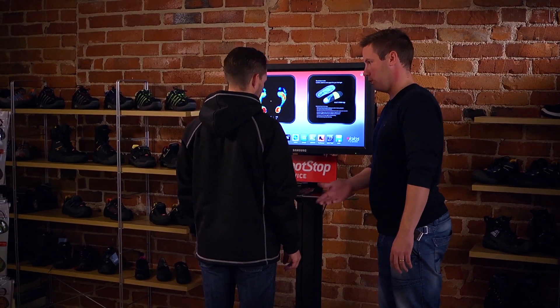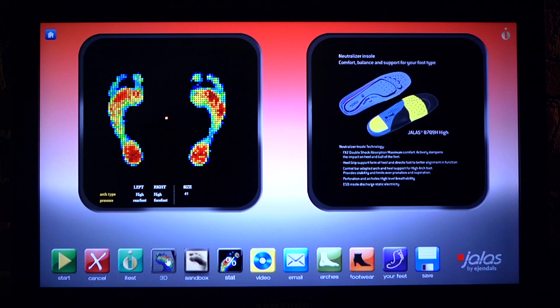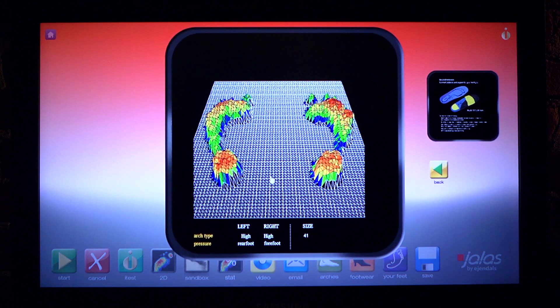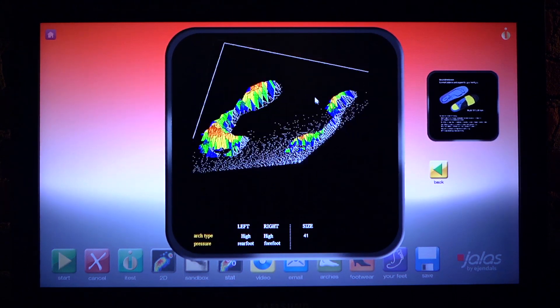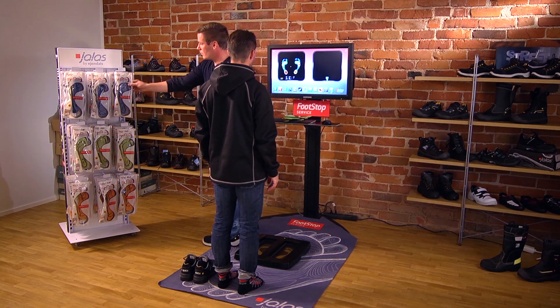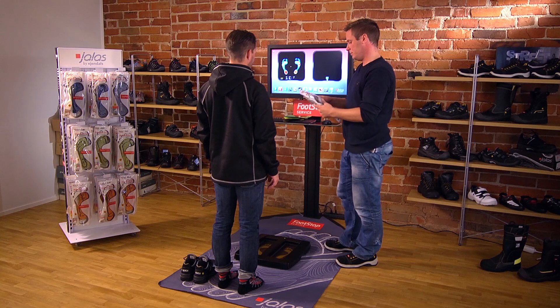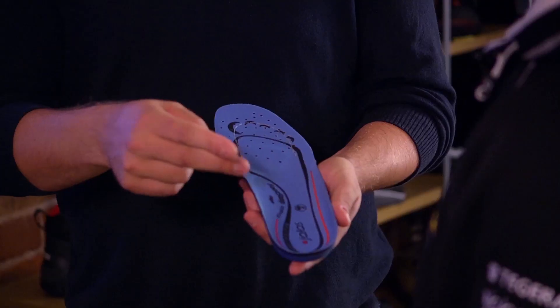It takes just a few seconds for the scanner to measure the width and length of the foot, the height of the arch and the pressure load points. You get the result immediately. The display shows how and where your feet are subject to pressure, as well as whether you have a low, medium or high arch.